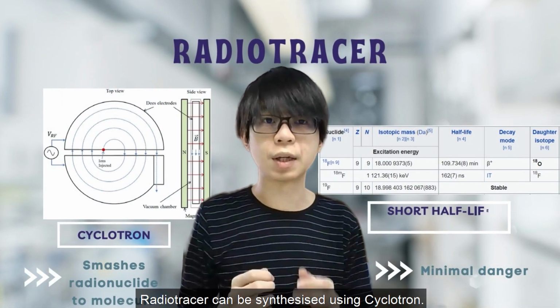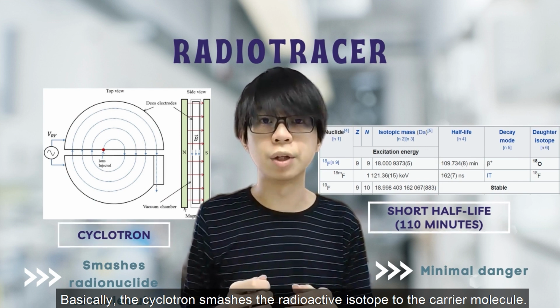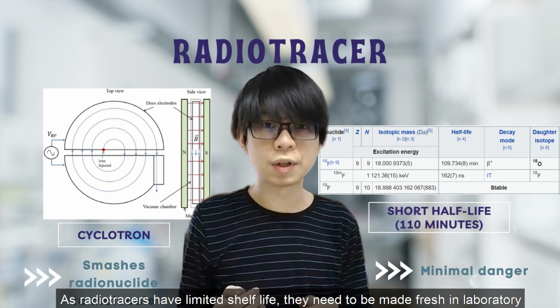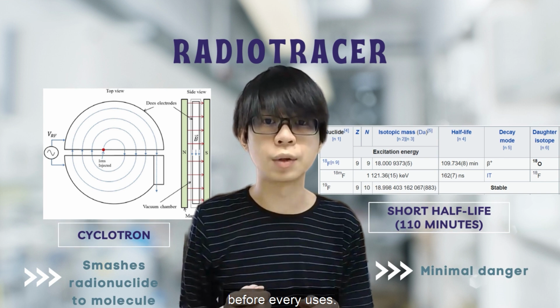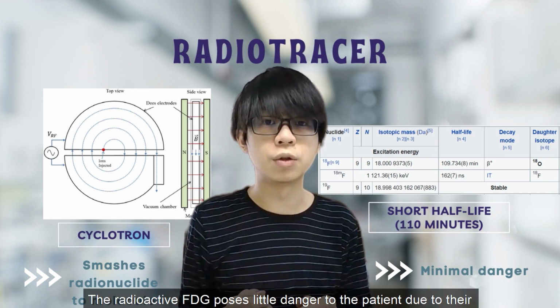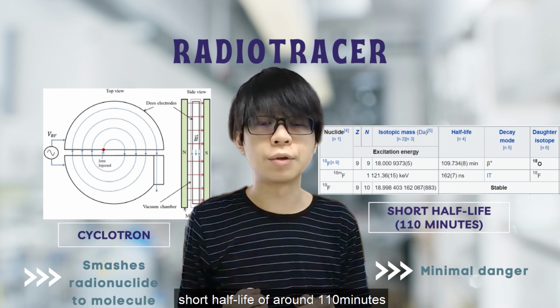Radiotracers can be synthesized using cyclotron. Basically, the cyclotron smashes the radioactive isotope to the carrier molecule. As radiotracers have limited shelf life, they need to be made fresh in laboratories before every use. The radioactive FDG poses little danger to the patient due to their short half-life of around 110 minutes.